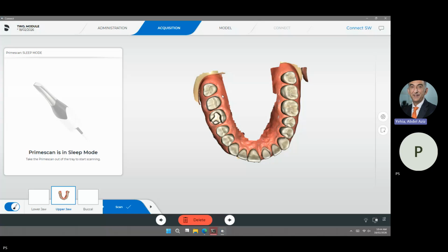I scanned, first scan was a palatal line, the palatal linear scanning, and then I returned on the occlusal, incisal, and then occlusal surfaces. And then labial, I took one half until the midline, and then I started from the other side and I took occlusal, labial, and then the other labial side in one go.